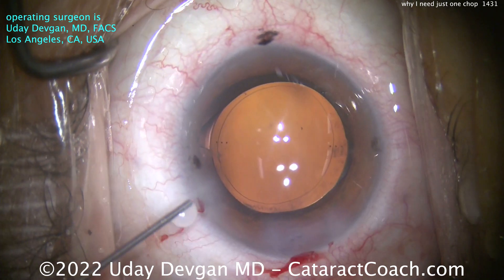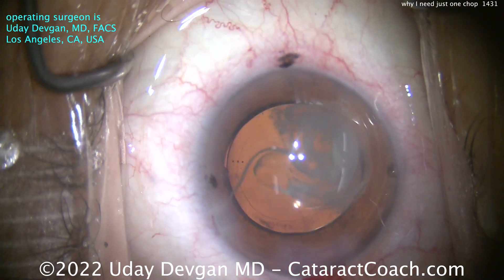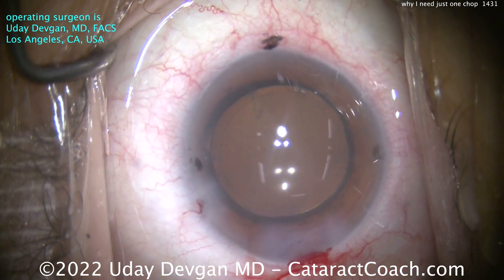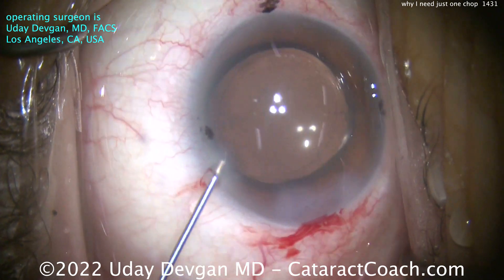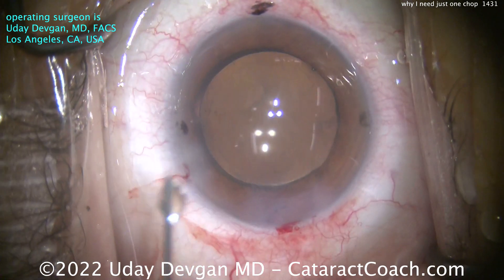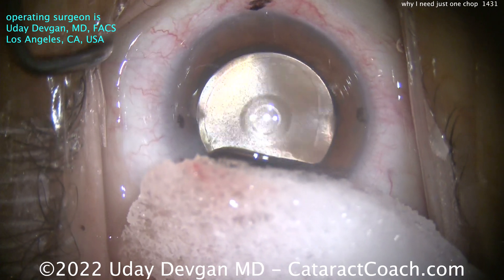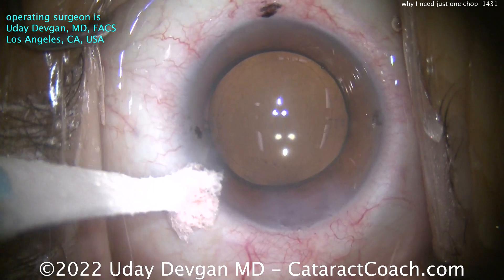At the end of the case, we'll add some Triamcinolone — about half to one milligram, preservative-free. Then some Moxifloxacin in the anterior chamber, also preservative-free, for endophthalmitis prevention. Finally, some Balanced Salt Solution to get the pressure where we want it. Sealing up the incisions at the end — they've already been hydrated. We'll use a Wexcel sponge with some Tetracaine and then a dry Wexcel. Those are my secrets for how I can do just one chop for a routine cataract case.